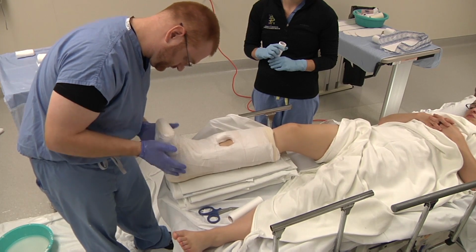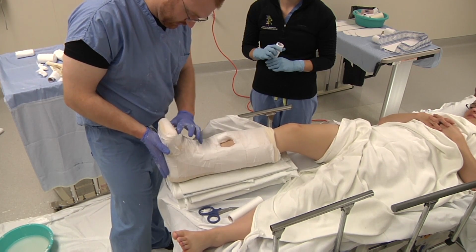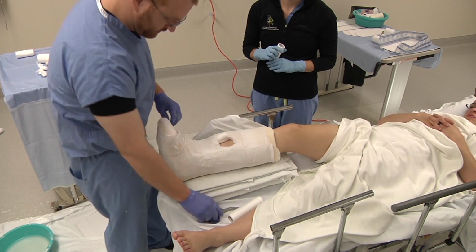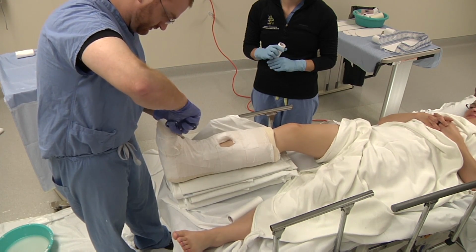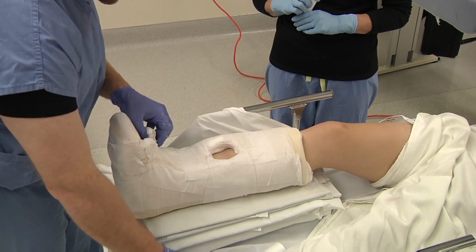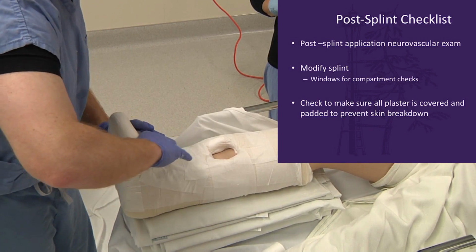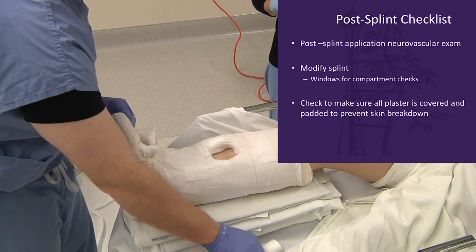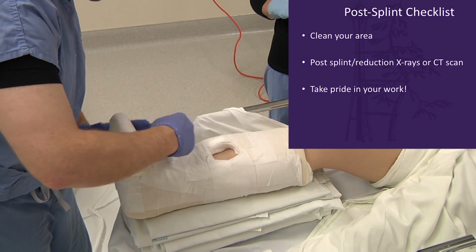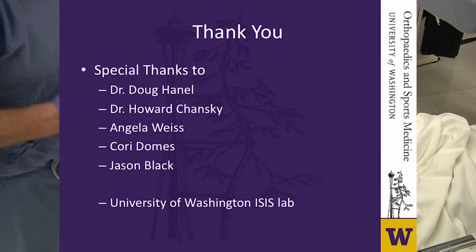The toes are able to be seen, and the patient can wiggle their toes. The dorsum of the foot can be palpated. If a Doppler ultrasound needs to be done, the splint can further be modified, taking care not to cut the patient, to a position where the dorsalis pedis can be Dopplered and or palpated. And then splint beautification can resume.